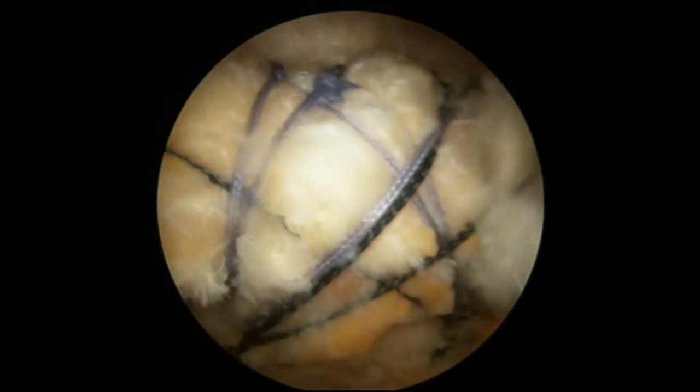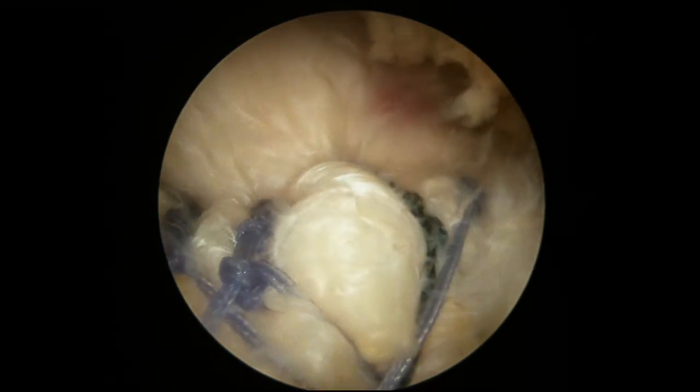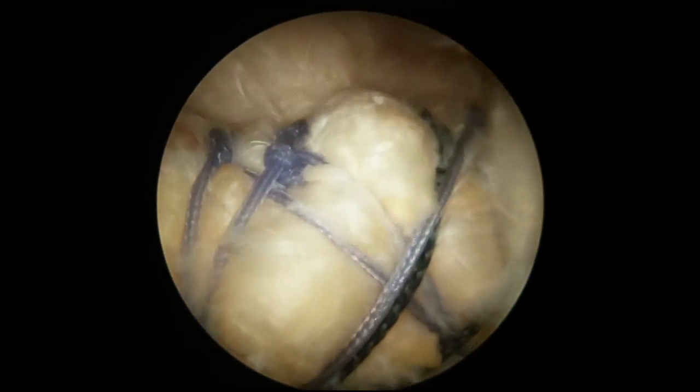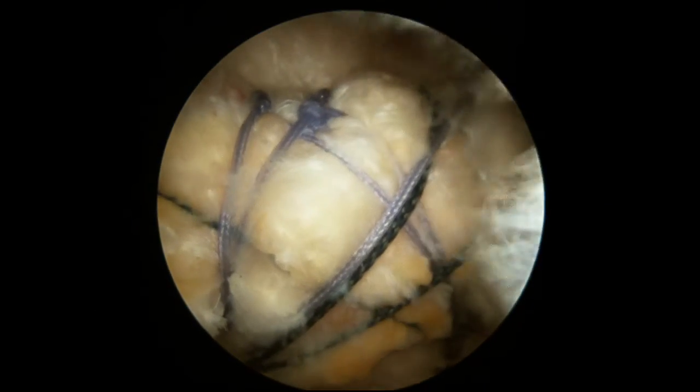This is the completed rotator cuff repair. You can see the medial row, how the tendon is flattened down, and those sutures going to the lateral row — we have sort of a web-type configuration. That's what allows us to really compress that rotator cuff down, and we have a great repair.